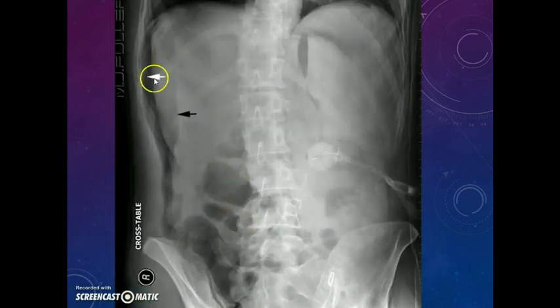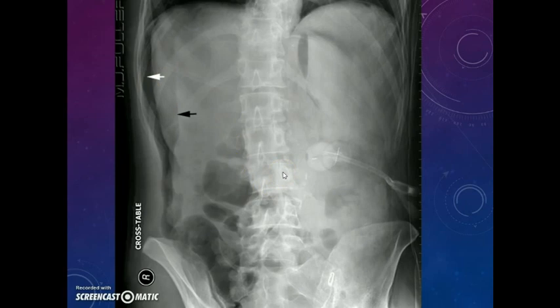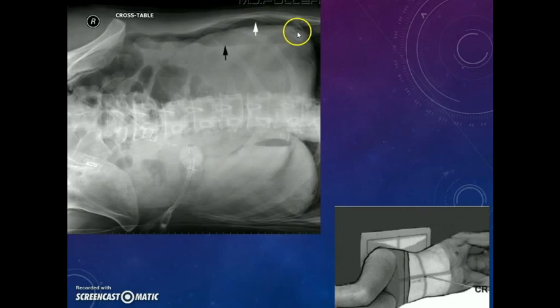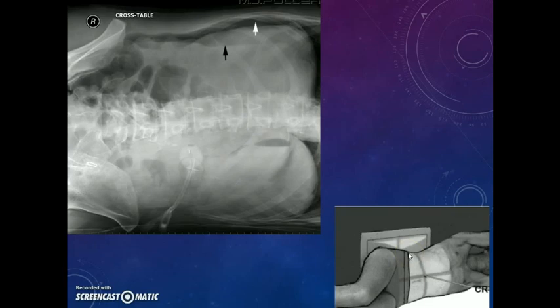What does this white arrow signify? It is also a case of pneumoperitoneum. You can see that we are not seeing it above the liver — we are seeing it towards the right side of the liver. Why? Because it is a left lateral decubitus view. The air floats above the liver, so instead of seeing it above the liver, we see it more towards the right side as the air floats. This is the importance of the left lateral decubitus view — sometimes a patient with peritonitis may be unable to stand up, and in those cases this view helps detect air under diaphragm.